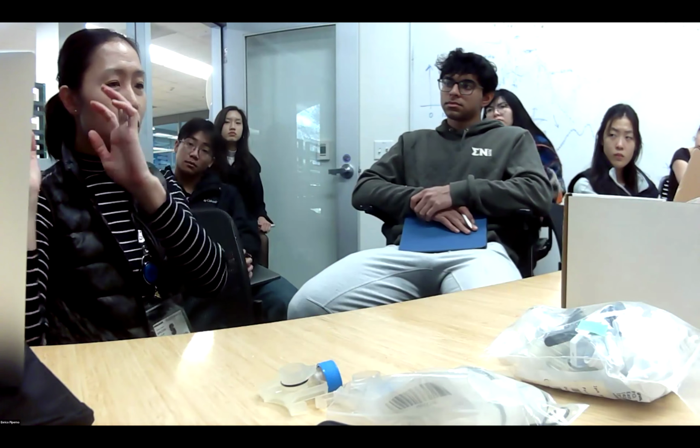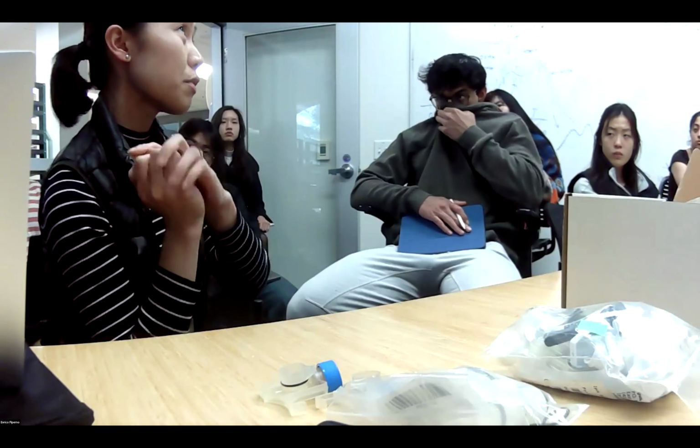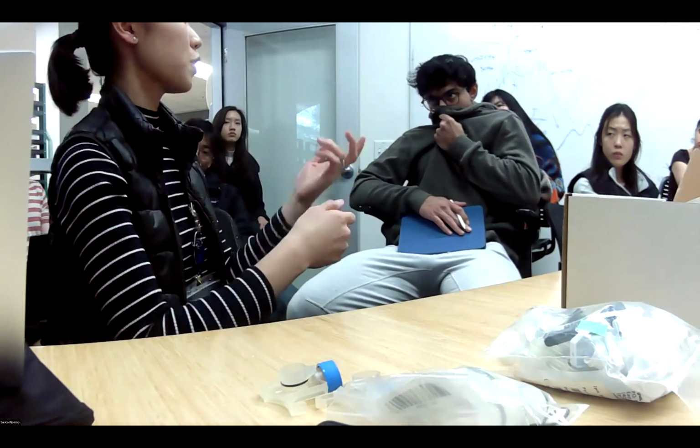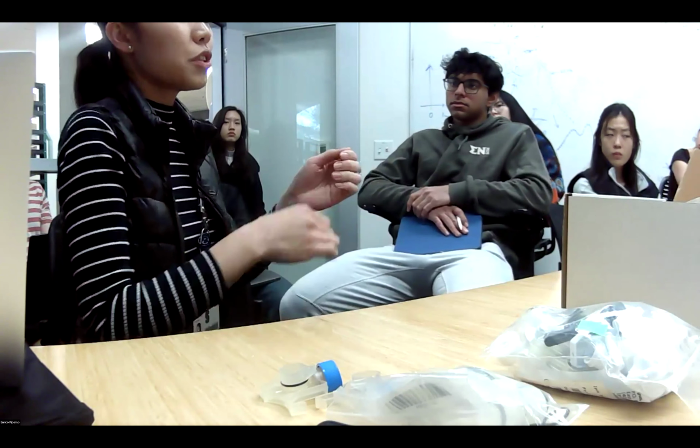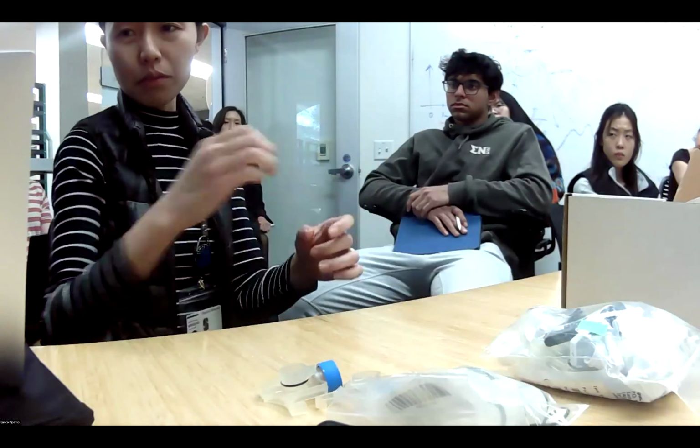So then that's when we were thinking, okay, how can we move, basically, what we have to do is move a certain amount of liquid past another chamber and past another chamber, sequentially. And centrifugation did that, but what other ways? So instead of centrifugation, it's more of a mechanical push, and that's when we had the plunger system, where we had first the larger volume being pushed into the smaller tube-like.